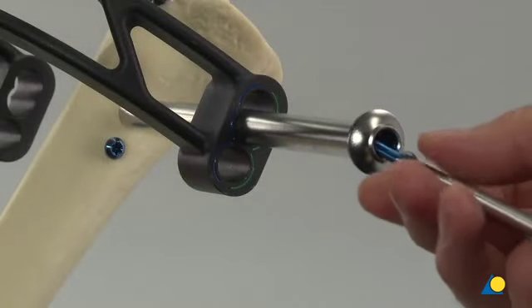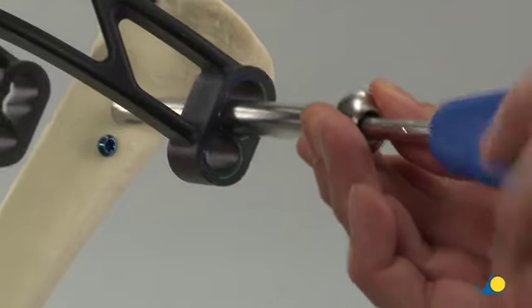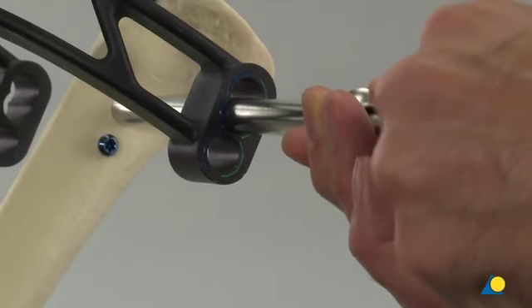The screw insertion sequence is repeated for the second mediolateral locking screw using the hole marked STAT2 in the aiming arm. In this case, a 40 mm screw is used.